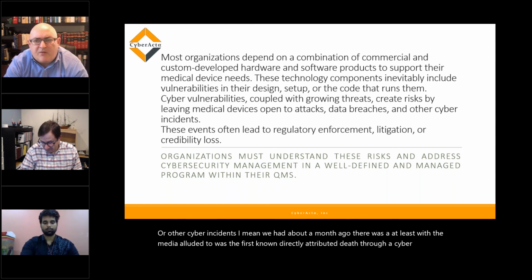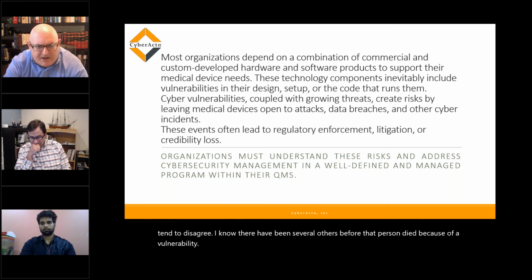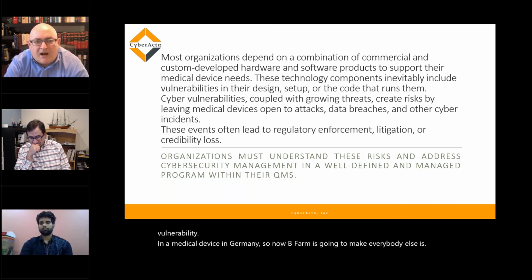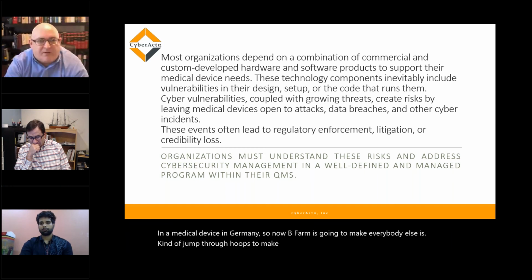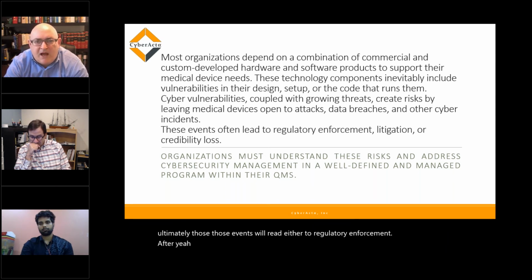I tend to disagree. I know there have been several others before that, where a person died because of a vulnerability in a medical device in Germany. So now BfArM is going to make everybody else jump through hoops to make sure that will not happen under their watch. But ultimately, those events will lead to regulatory enforcement, FDA, EMA, BfArM, you name it, litigation, again especially in the US, or credibility or customer loss. That's just something that comes with it.